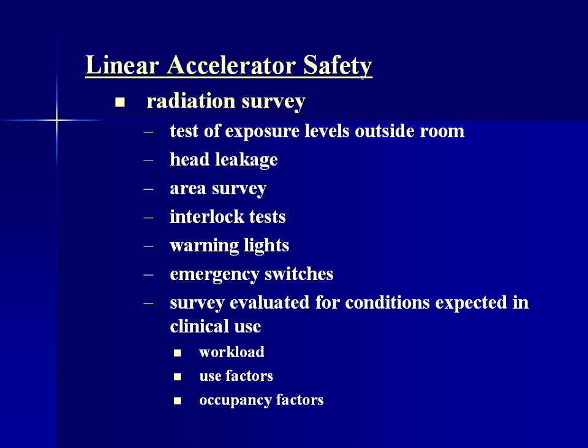He had left one off, the one that was straight on, and we discovered that on an annual check. So there was radiation essentially pouring out of the front of the machine. That's not that important to radiation workers, but it did give all of those patients a little extra dose outside of their treatment area. So these things can happen.